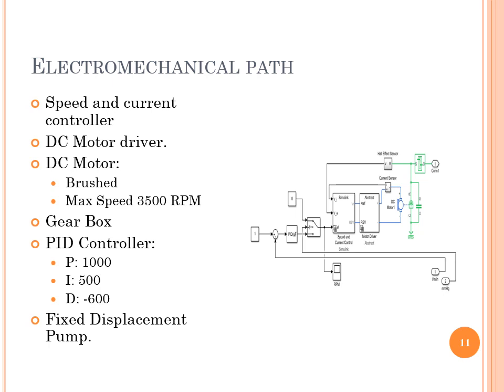Next, we have the main mechanical components, the DC motor. It provides the given torque that moves the fluid. It's a brushed DC motor with a maximum speed of 3,500 revolutions per minute. After the motor, we have a gearbox. It's the interface between motor and pump head to help provide a higher torque. Finally, we have a fixed displacement pump to serve as the peristaltic pump head. It is the interface between the mechanical part and the fluid hydraulic part of the system. It squeezes the tube, moving the fluid at a given flow proportional to the rotational speed.